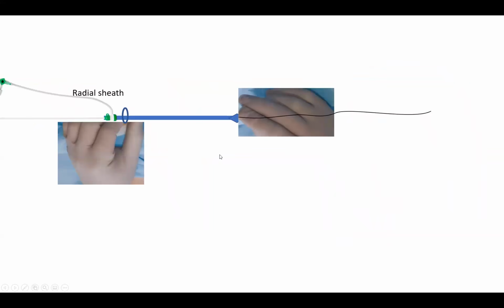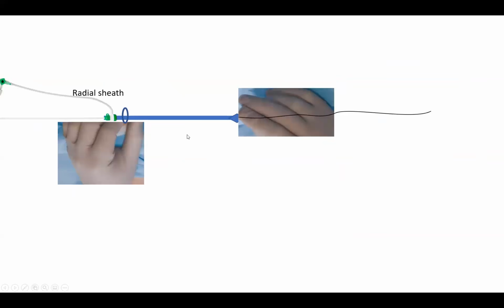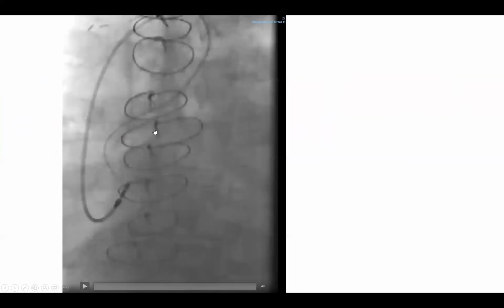And as I explained, during those maneuvers, as you're advancing the catheter and torquing, both your hands are on the catheter for coronary engagement, while somebody is loosely holding the wire. You also need to be able to move the wire, because you see here, for example, the wire flies out. So you need to be able to readvance the wire.